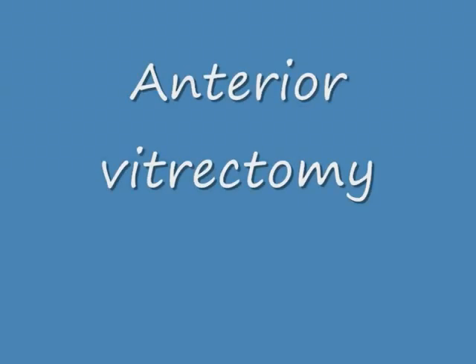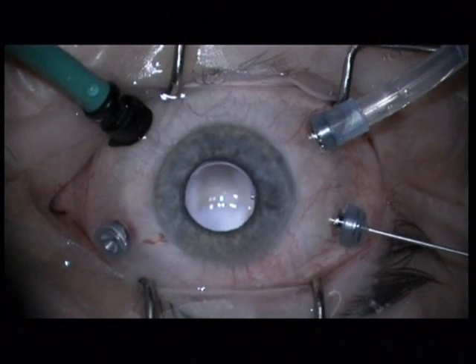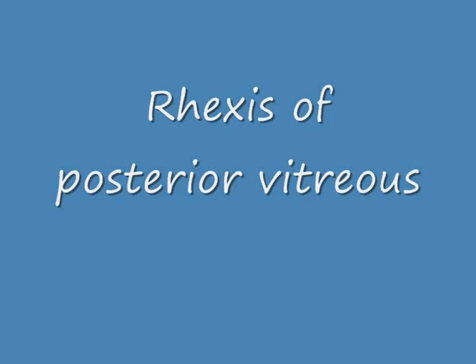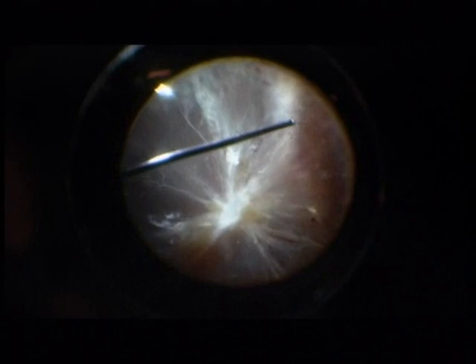The next step is lensectomy. The lens removal allows a complete removal of the anterior vitreous. Here you see the total PVR detachment. The first step is rhexis of the posterior vitreous, or you can say rhexis of the posterior hyaloid. The posterior vitreous is often detached in the periphery, often attached at the nasal pole, and almost always attached at the posterior pole.